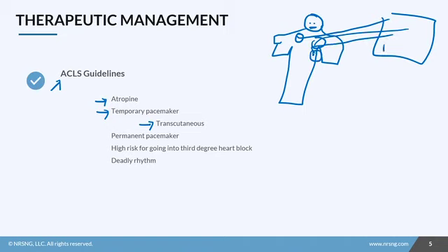And I turn the machine on to pacing. And so it sends, so we'll do it at 60 beats per minute. So at 60 beats per minute, it is sending electrical impulses to the little pacer wires and transcutaneously gets down to the heart. So the heart is being shocked and it's pacing. This is done in case they go into third degree heart block or if the second degree type 2 is severe enough and they are unstable and very symptomatic.